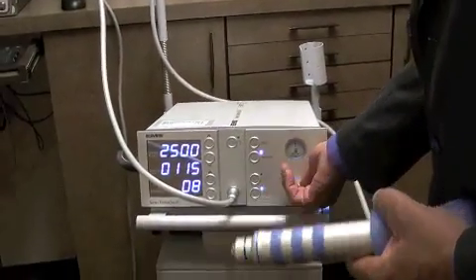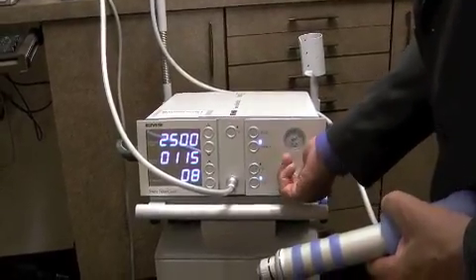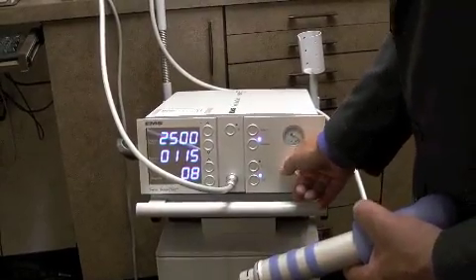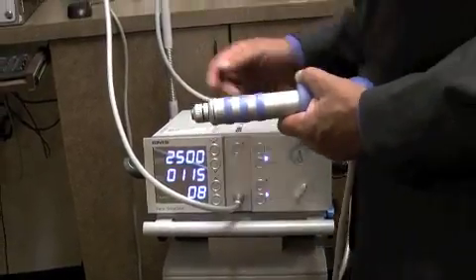Next, I'm going to turn this pressure all the way up to 4. This is now almost 61 pounds of pressure for every one of these little bounces. And I'll put my hand on it. Don't do this at home.